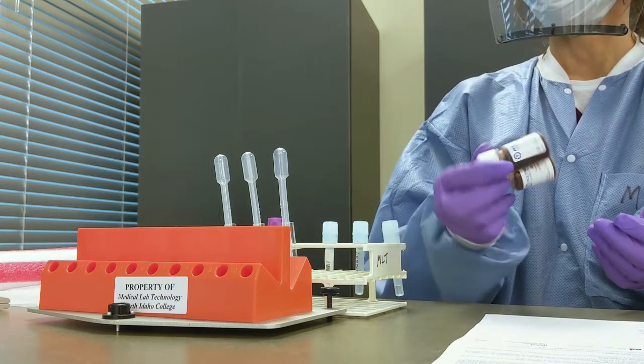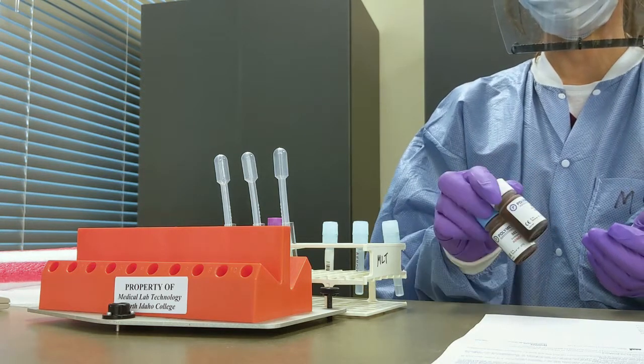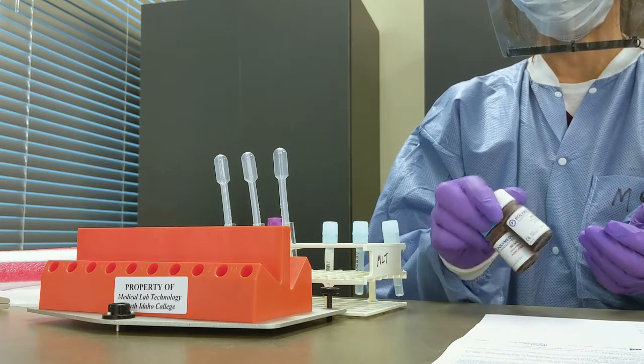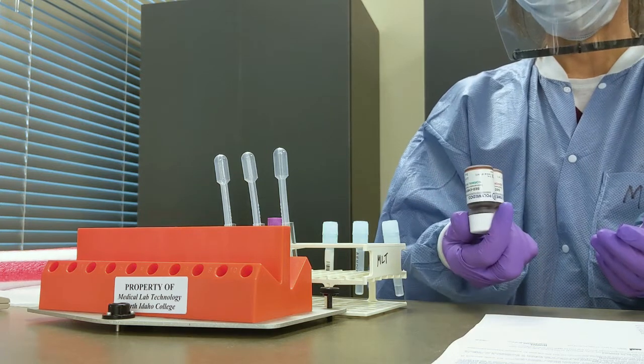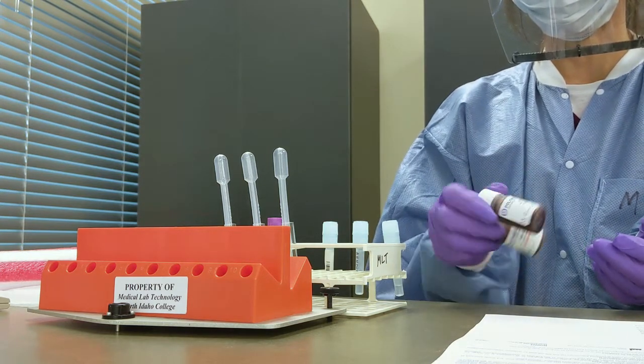This is a very crude test that is an indicator of inflammation. One of the things you're going to find out on internship is that some smaller labs will still set these up manually. It's not hard to do, but it's important to know how.